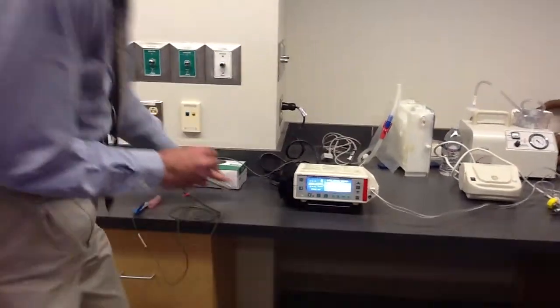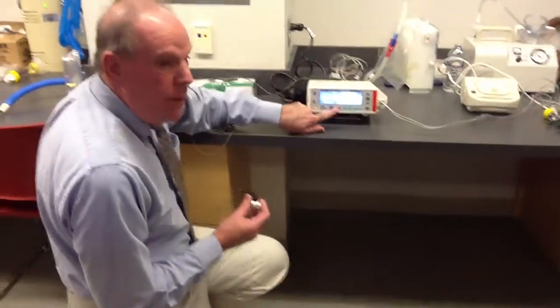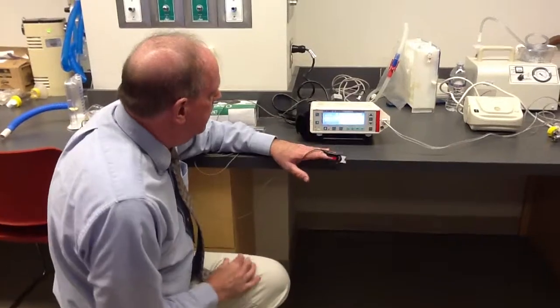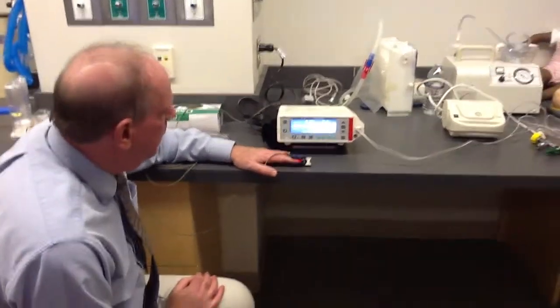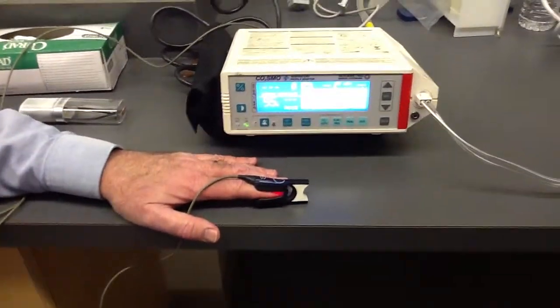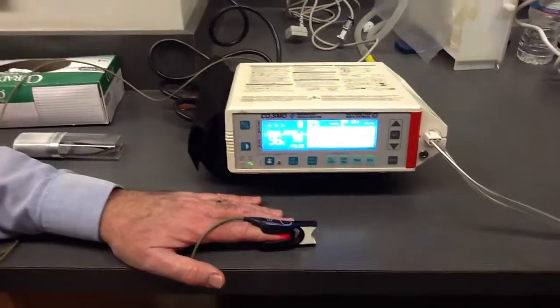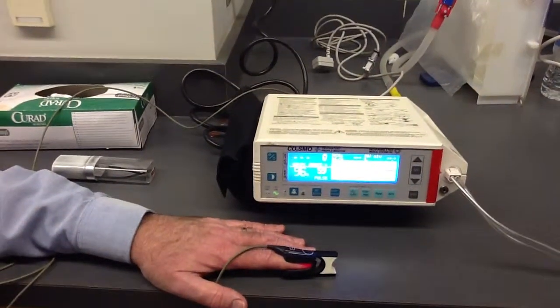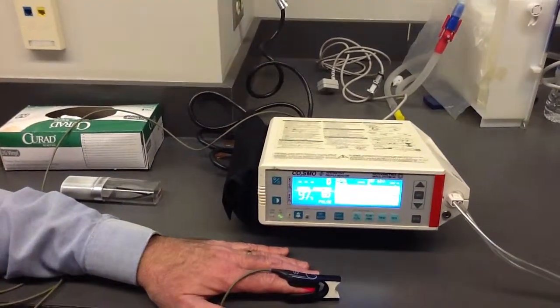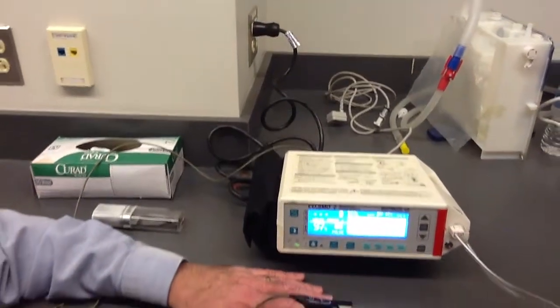Pulse Ox seminary. What you can see is currently no reading. If I put this on, the value is reading — give it a second. Do you believe, looking at this, that my Pulse Ox is 97%? That's what the monitor reads. Yes or no, and why?